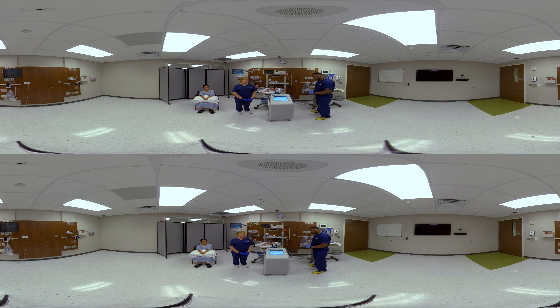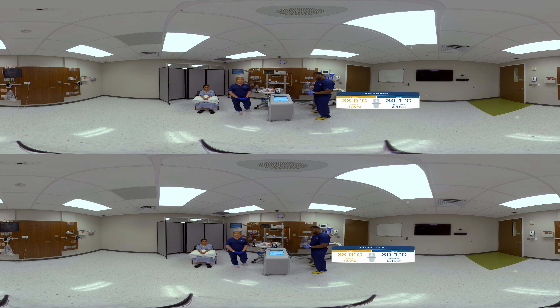Over time, you will also see the patient trend indicator located next to the patient temperature. The trend indicator tells you what your patient's temperature has been trending over the course of the last five minutes. When the arrows are lit up in the downward direction, that means your patient is getting cooler. When the trend indicator is neutral, it means that your patient's temperature is not fluctuating. When you see the arrows pointing up, that's an indication that you should assess your patient for heat generation, such as shivering, seizure, fever, internal bleeding, or other sources of heat generation.